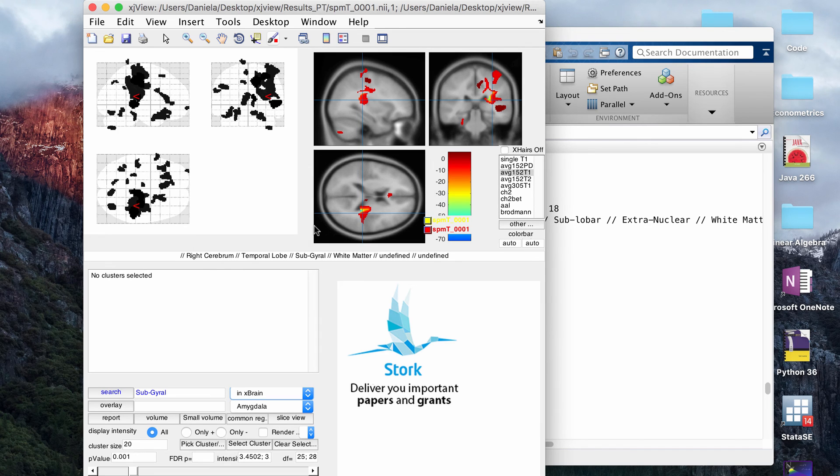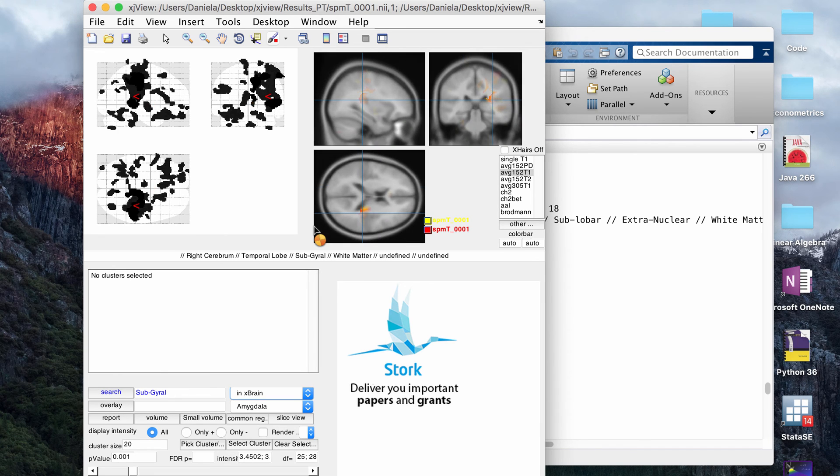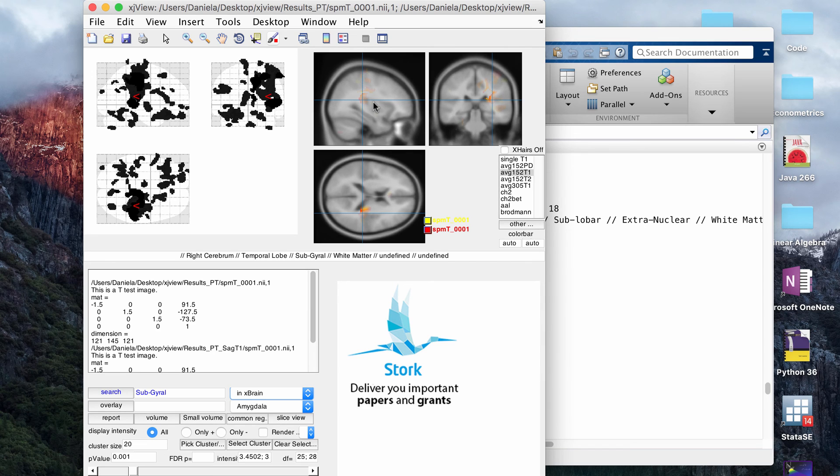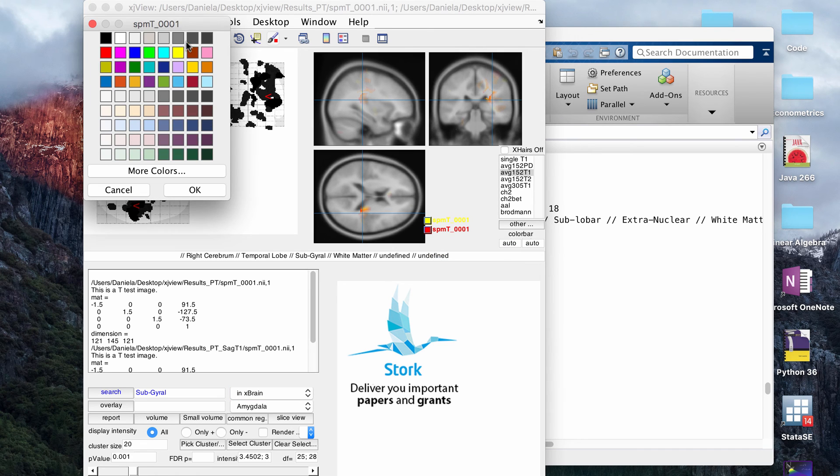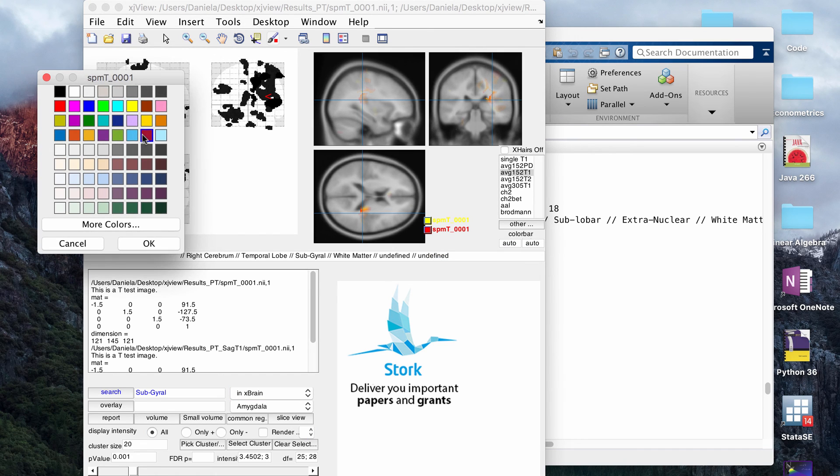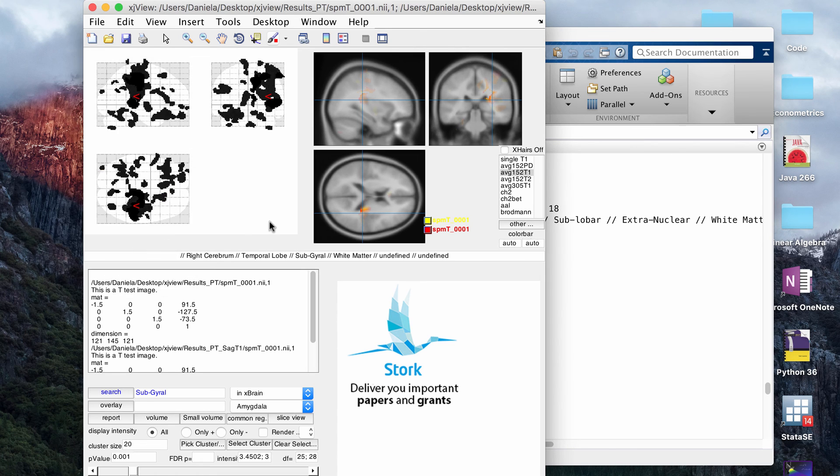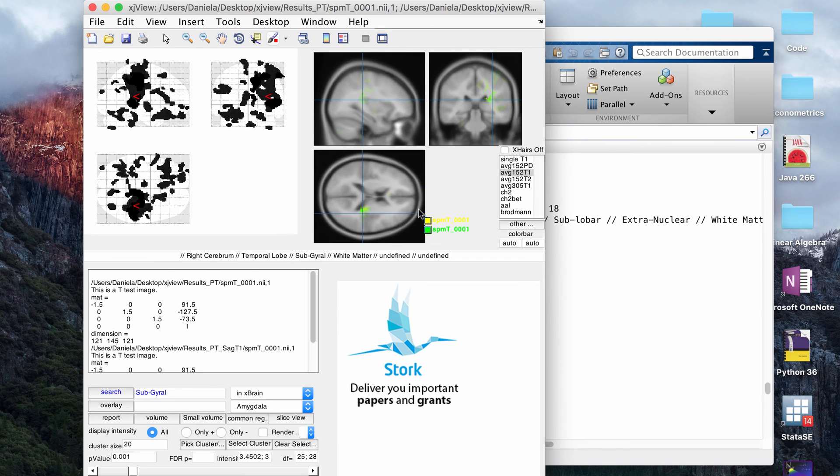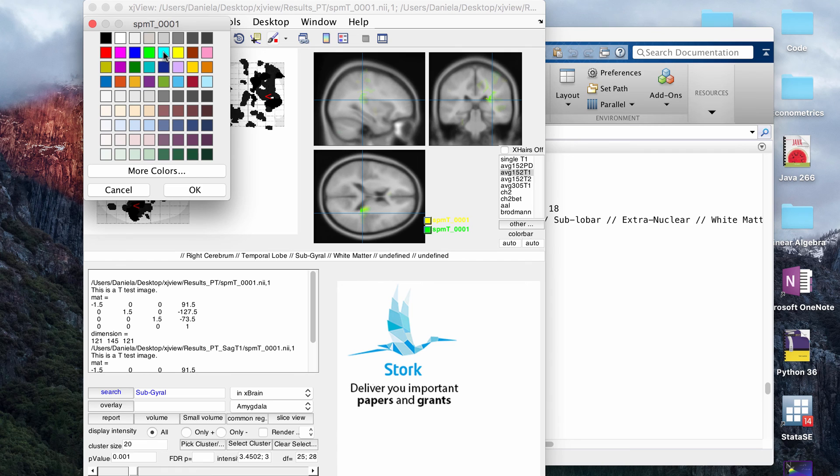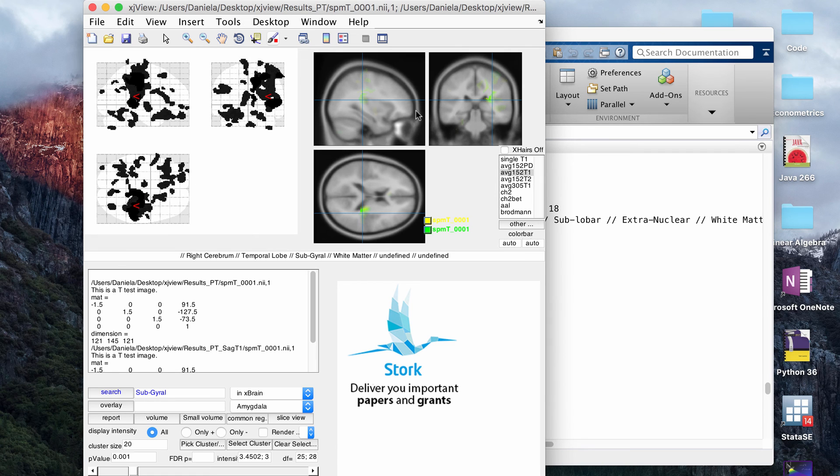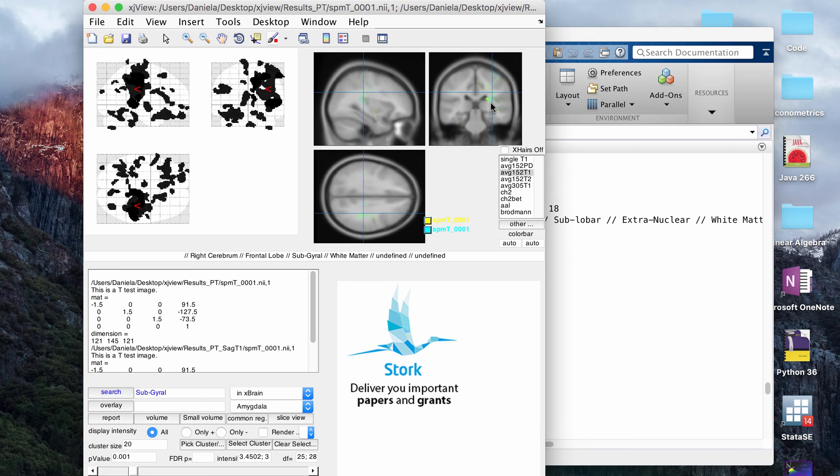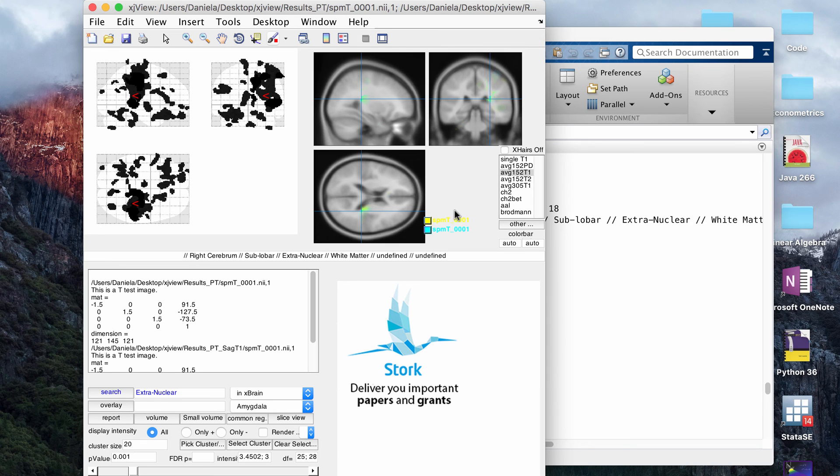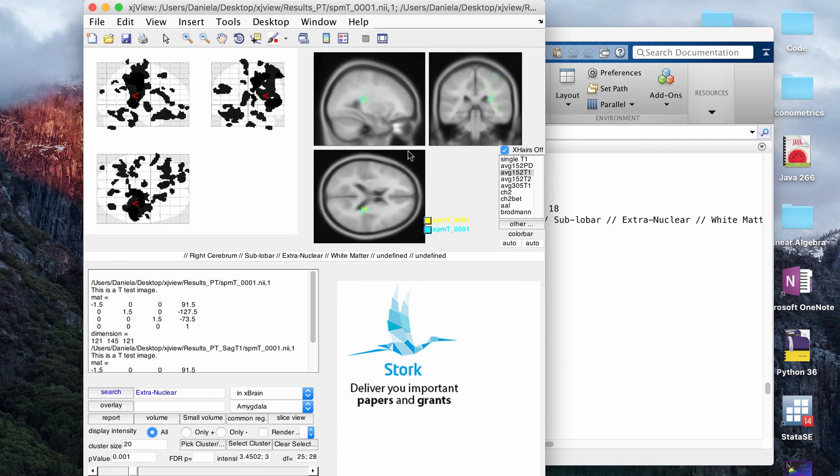Now, these are from different studies, so it gave me a little warning window that went away that says these are from different sources, but that's okay. Now that you overlayed it, you can't see it very well. It's overlaying basically the two TMAPs and the colors you can pick. If you want to change the colors... actually, on this computer, it gives me a lot of options. On my work computer, it only gave me like 10 colors to pick from, but you can pick two colors, like two primary colors, to see like a secondary color for the overlap. Again, you can't really see it very well, and it overlaps a lot because in this image, this schizencephaly obviously shows up for both scans, but if you can kind of see it looks green a lot, which is the yellow and the blue overlapping. Here you can kind of see that this area is a little bit yellow, so it's just showing up on one of the files, and it's a little bit blue here, so that's showing up on the other file. That's really nice as well.